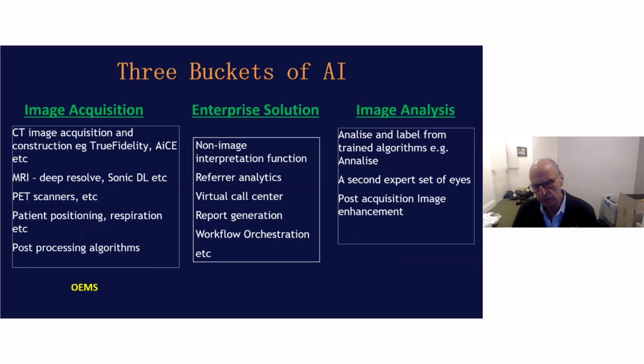The next bucket is what I call enterprise solutions. These are all the non-image interpretive functions that we perform. And this could be things like referrer analytics, online booking, virtual call centers, etc. And I'm going to talk about some of those which we're actually currently undertaking in I-MED. Then the final piece is image analysis. An example is Annalise, which is a company we were a part of, where we train algorithms to look at image interpretation and findings. It's like a second expert set of eyes.